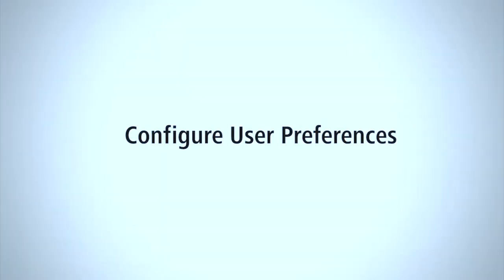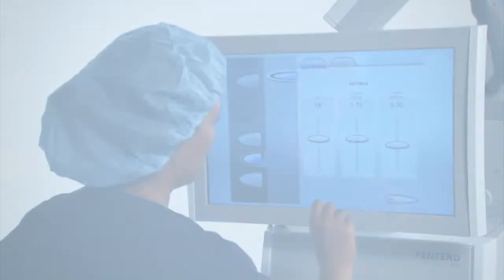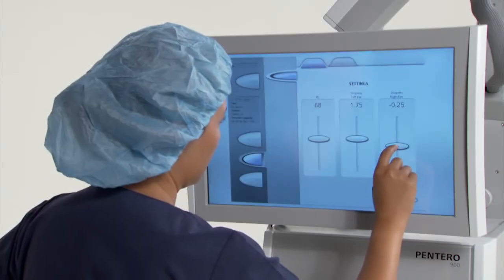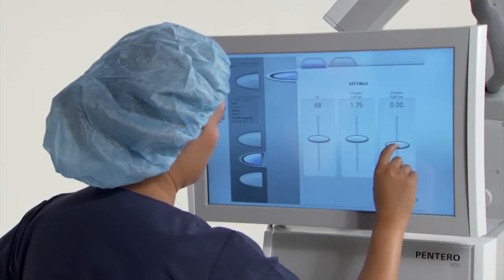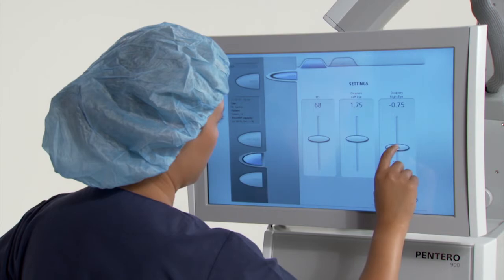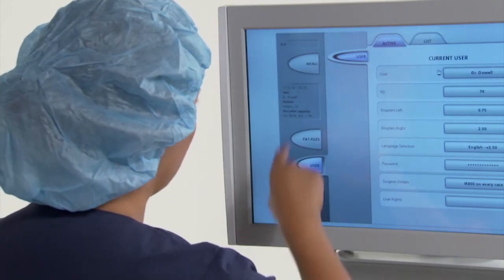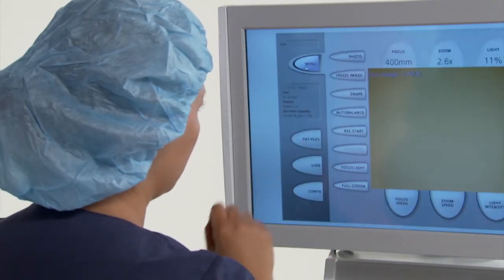To configure user preferences, select a function and use the sliders to change the value. Then press OK. Press menu to exit.